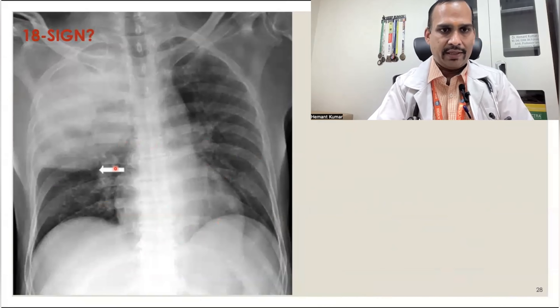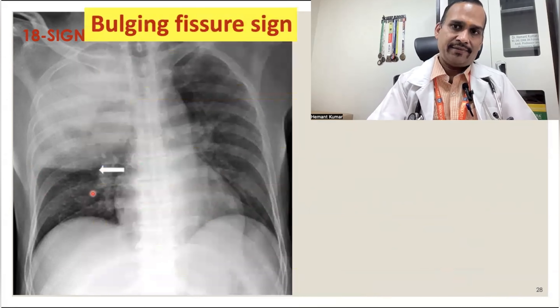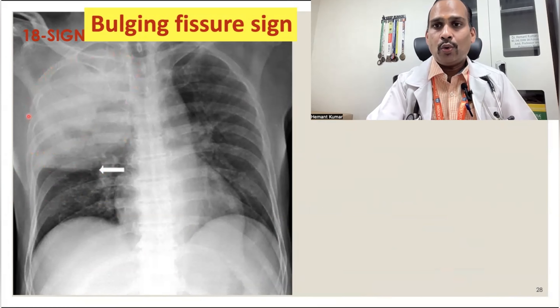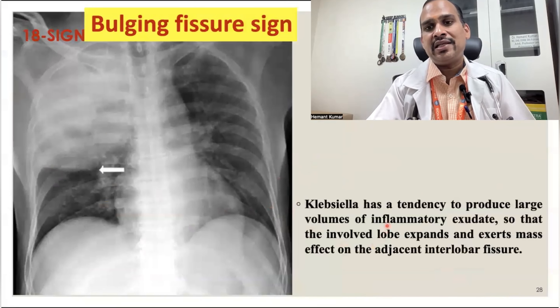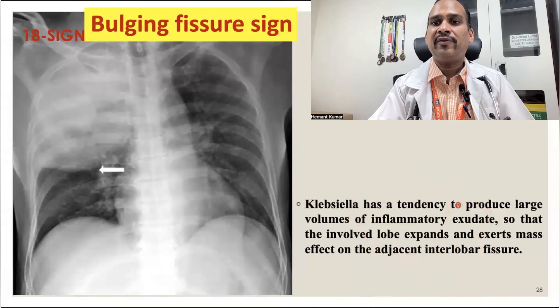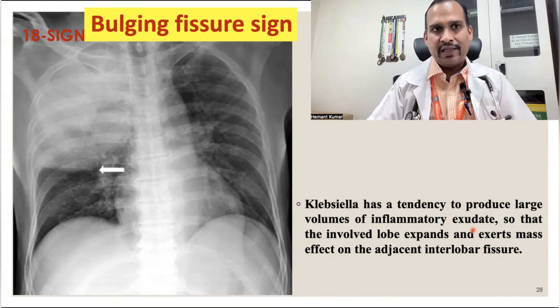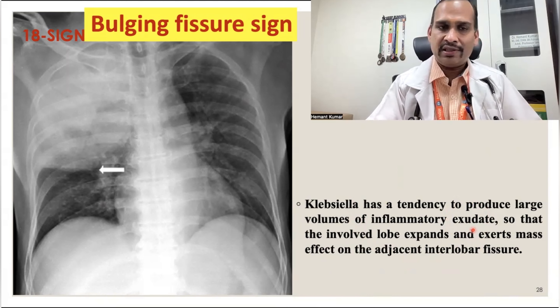Sign 18 is the bulging fissure sign. There is bulging of the minor fissure due to overfilling of the right upper lobe consolidation. Because of consolidation, the minor fissure bulges downward. This is typically seen in Klebsiella pneumonia, because Klebsiella produces a large volume of inflammatory exudate that pushes the minor fissure downward. Previously it was common, but due to potent antibiotics, it is not seen as commonly nowadays.